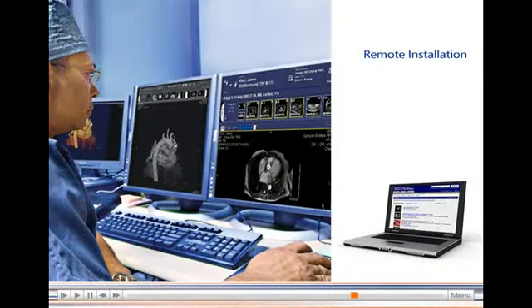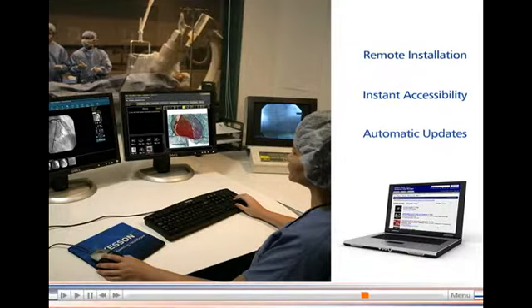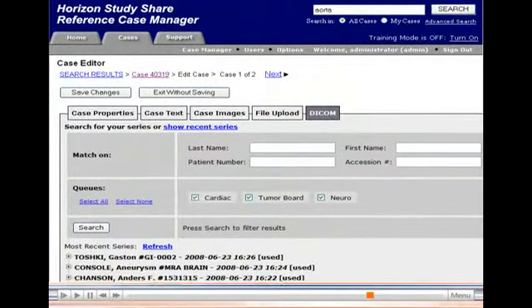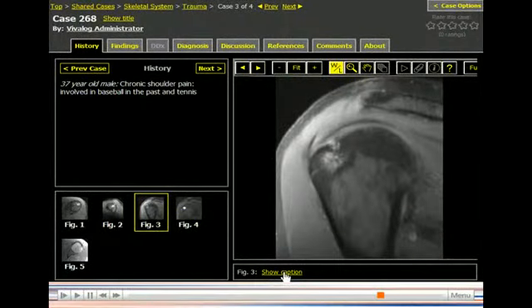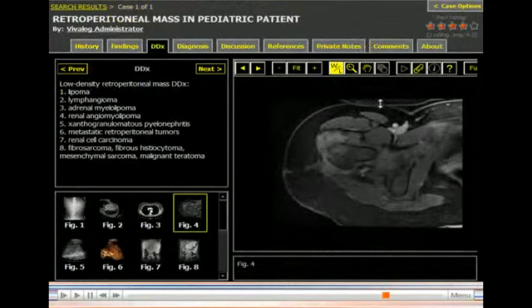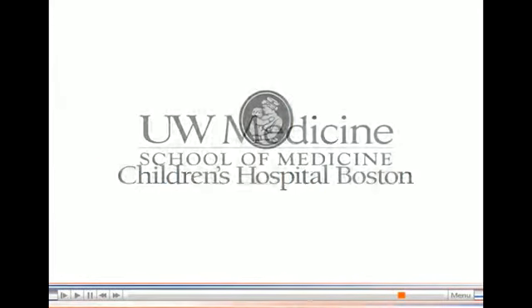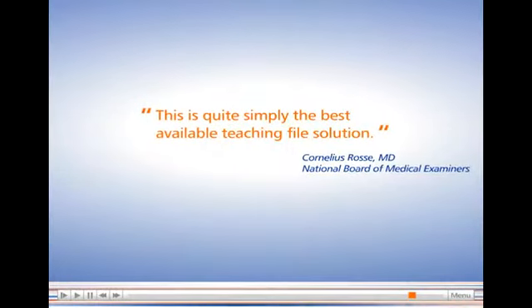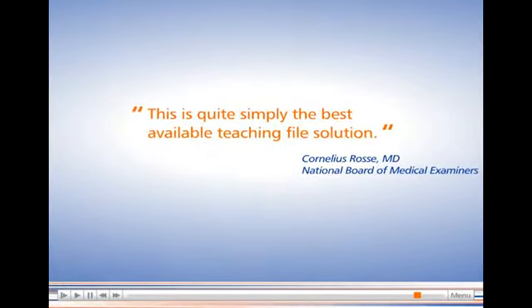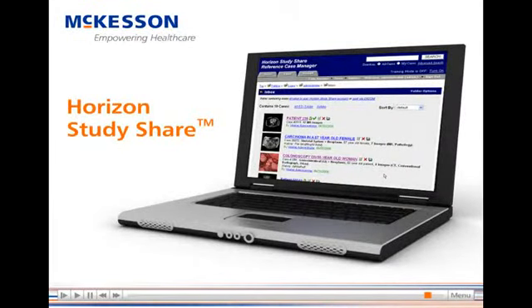With no deployment effort, no formal training, and no maintenance required, Horizon StudyShare makes it easy to capture and manage the knowledge required to enhance patient care, support diagnostic decisions, and build an impressive legacy of teaching and reference files. Discover what thousands of users at major U.S. teaching institutions already know. Discover the power of Horizon StudyShare.